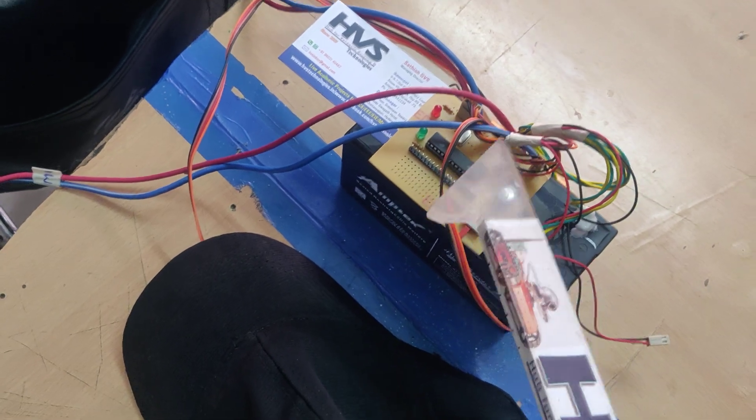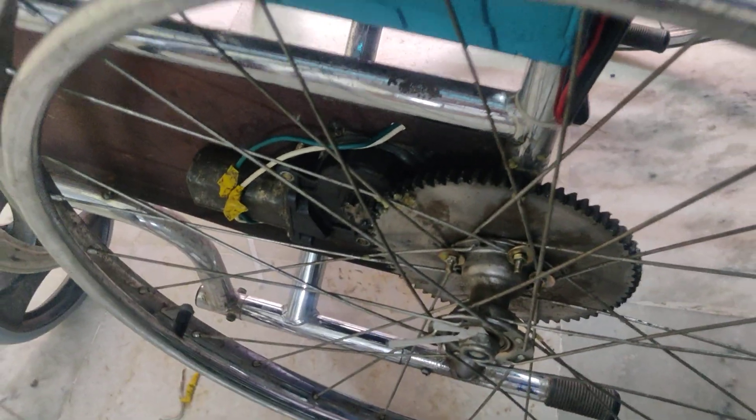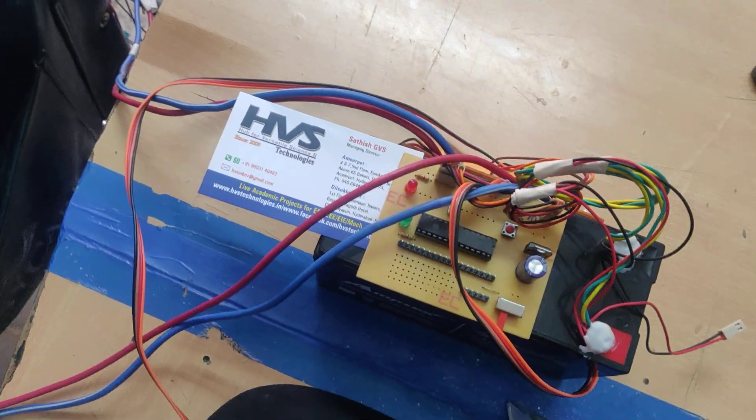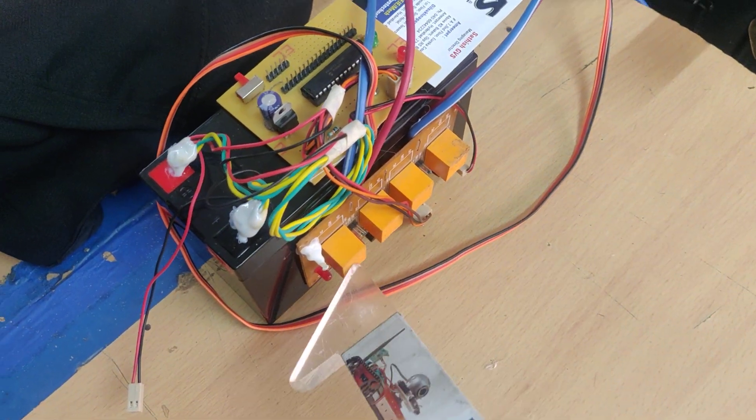Based on the input signals, we are going to control two DC motors which are attached to the wheelchair with gears. The signal is given to the DC motors through a four-relay board, where two relays control one DC motor and the other two relays control the second DC motor.